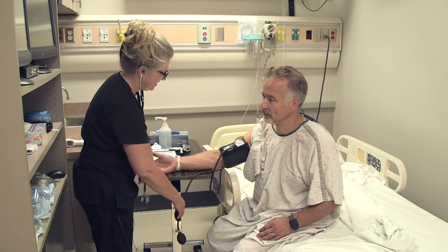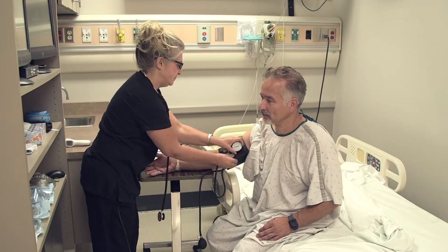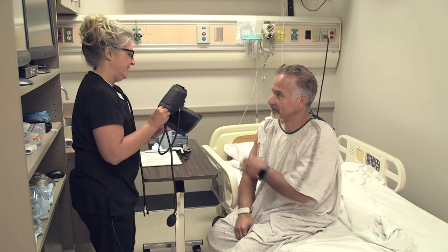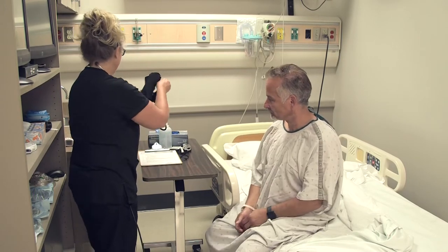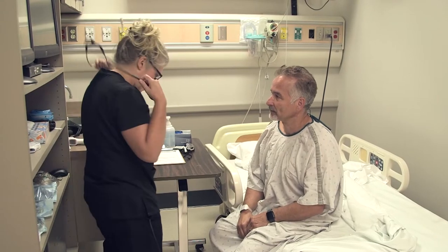Okay, good. All right, Tim, I got 140 over 80. All right. Isn't the worst. Okay. And then we're just going to set that back there. And now I'm going to go ahead and check your pulse.